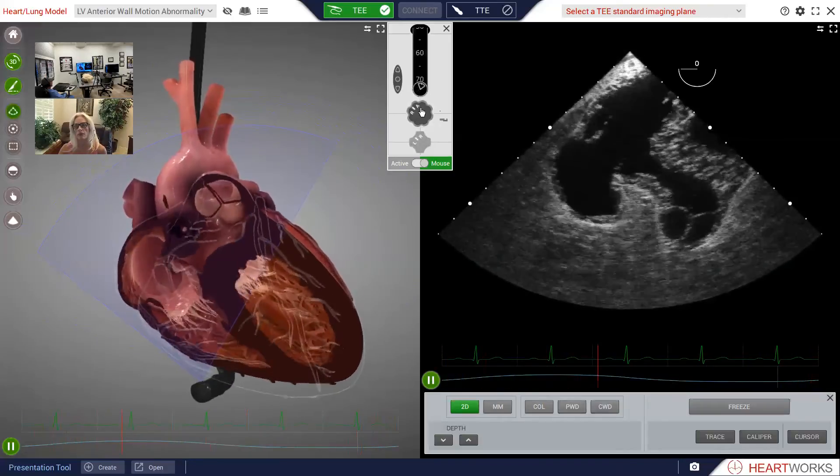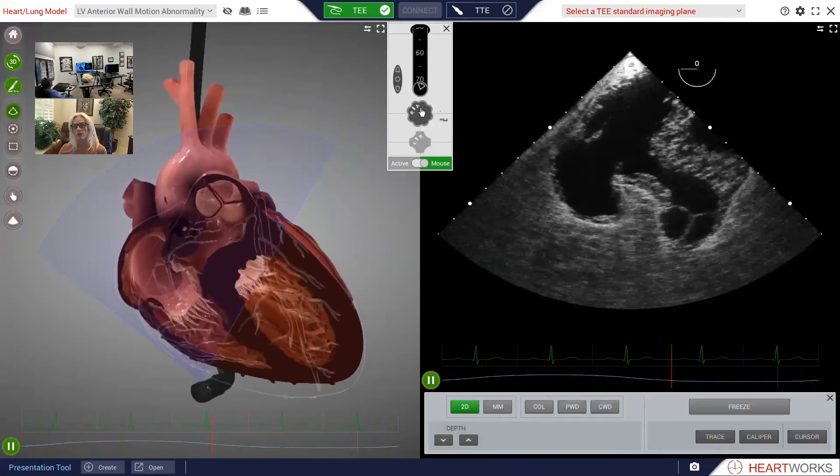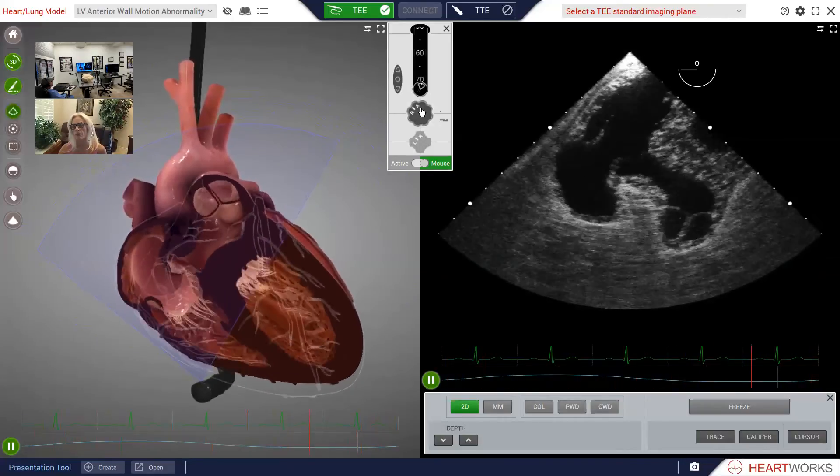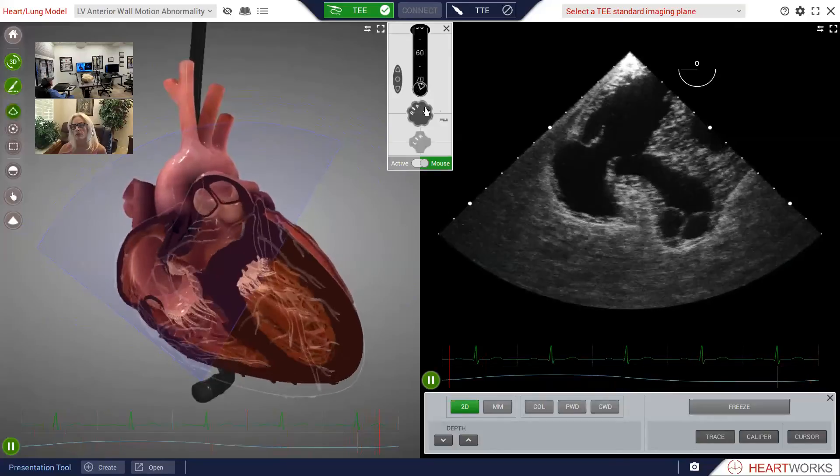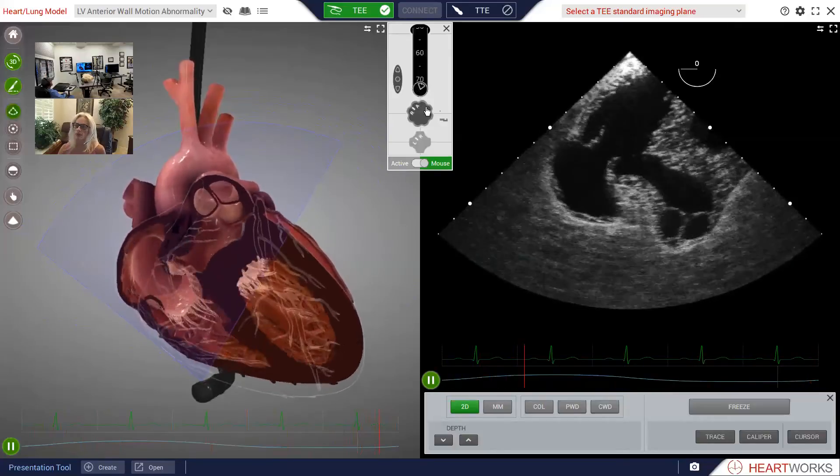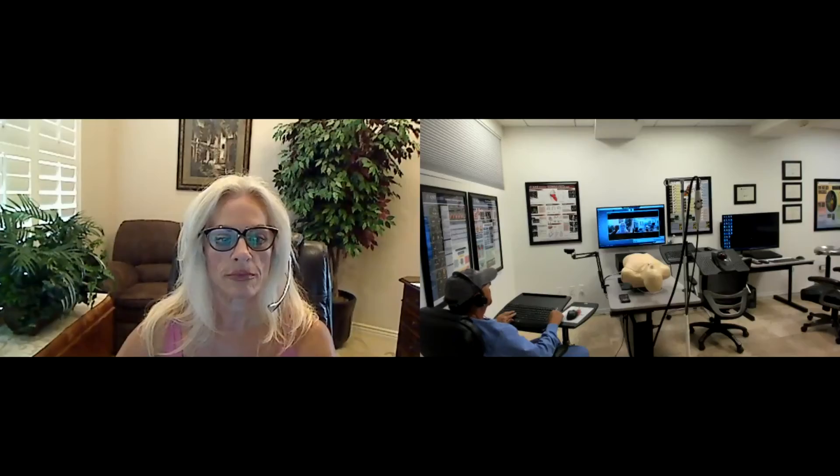There — maybe just a hair more. Very nice. Now you have the view. I hope that really helped you and clarifies how to get that view. It did, thank you very much. You're very welcome. Good to see you again. You too. Bye for now. Bye.